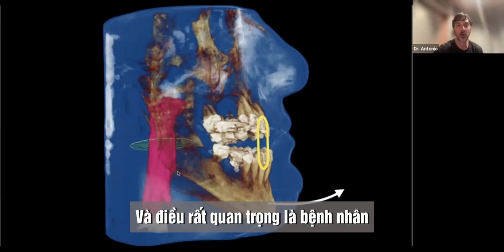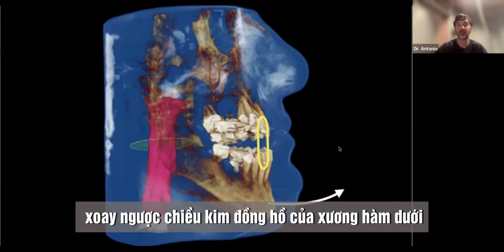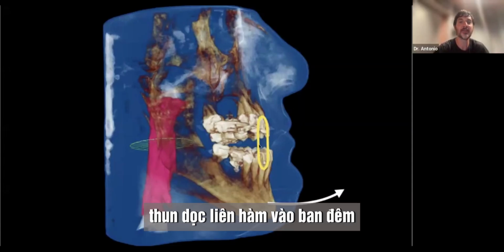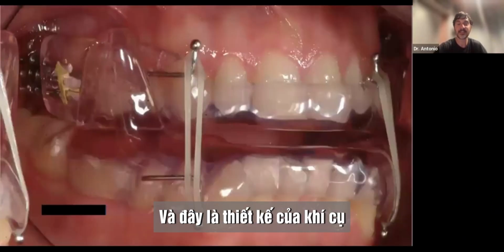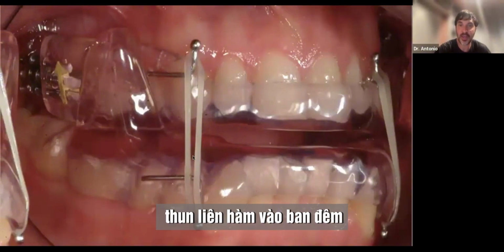And it's so important that the patient has to move the mandible forward in the so-called counterclockwise rotation of the mandible. But it is so important that the patient also uses intermaxillary vertical elastics during the night. And this is the design of the device. And we always ask for hooks just to use intermaxillary elastics during the night.